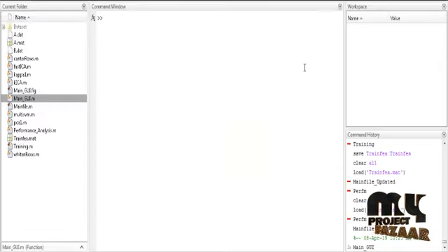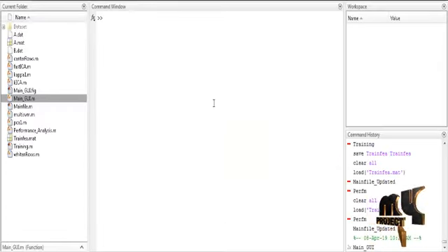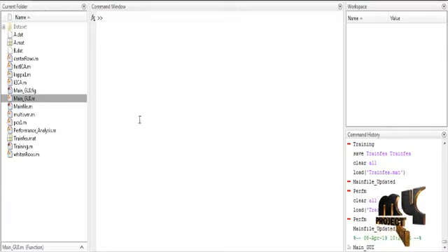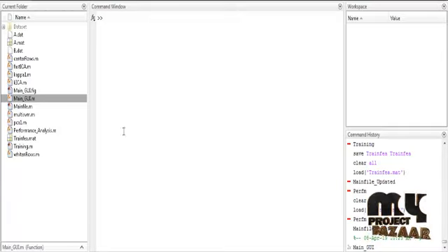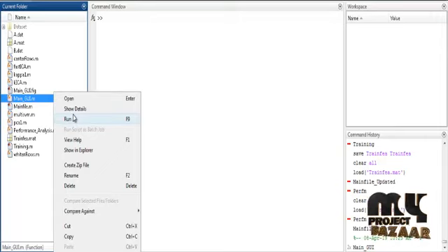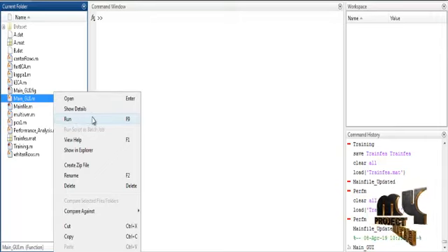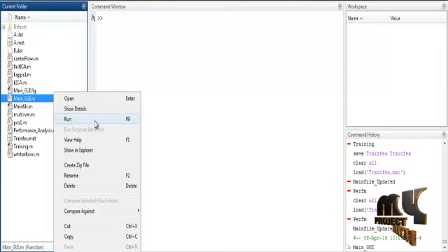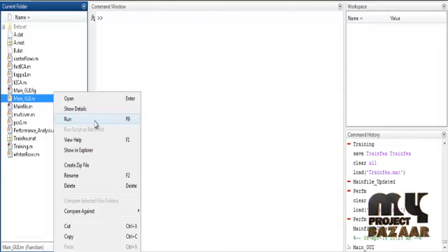Now we are going to discuss the initial running procedure. First, open MATLAB 2015B and change the current directory. To execute the code, right-click on main_GUI.m and select the option Run.